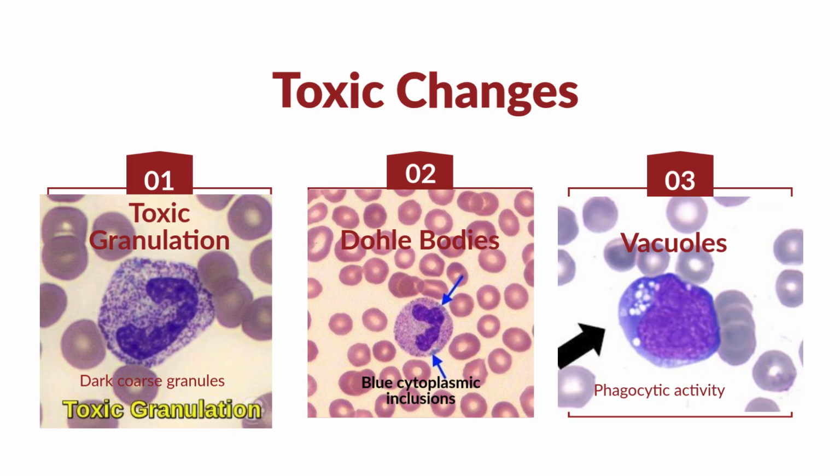The neutrophils retain more prominent granules than usual. Dark granules are angry neutrophils. So remember, they're like, oh my God, you got me out here working overtime. Here's another pearl. Toxic granulation strongly suggests bacterial infection, sepsis, or severe inflammation.